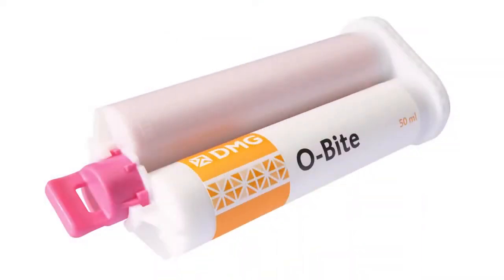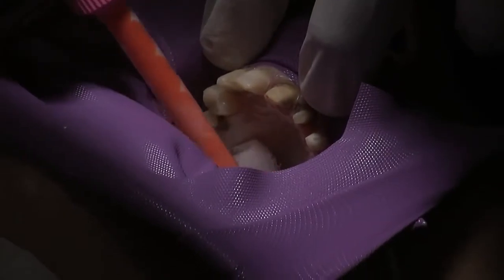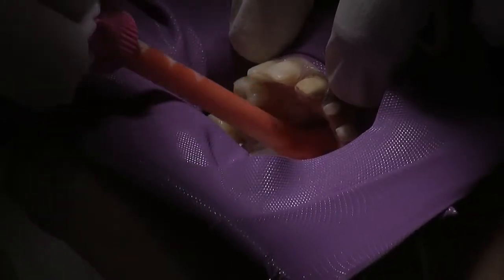And then I actually like using Obite, which is the bite registration paste. I'm just going to put some here, all around the back, and I'm going to go right up to the vault of the palate to completely seal up the area.